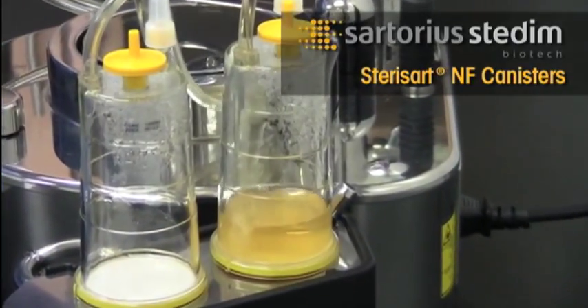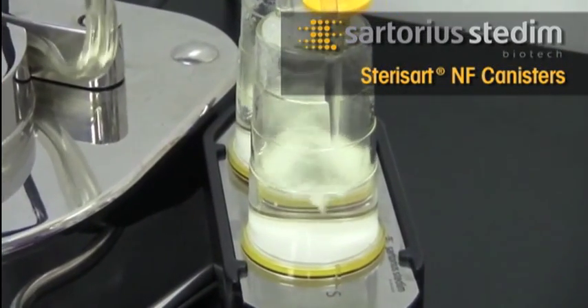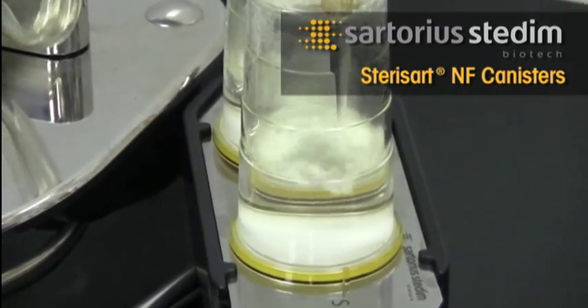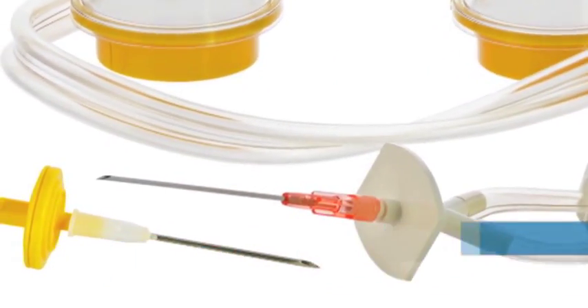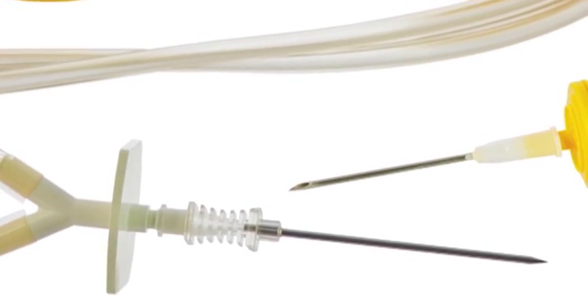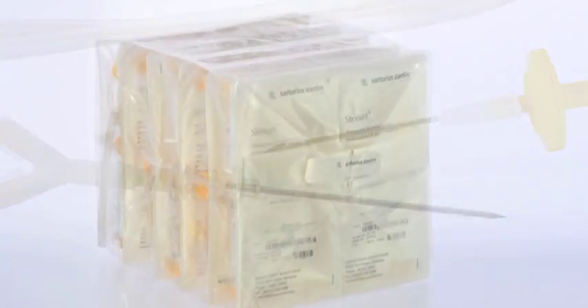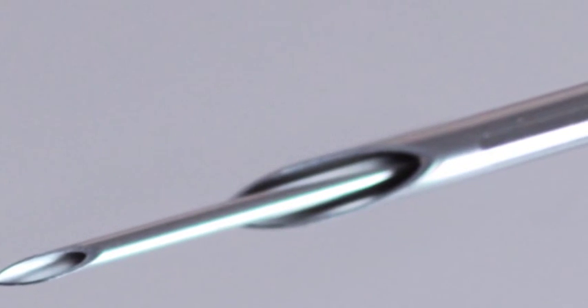The Sterisart NF canisters for sterility testing are disposable sample containers for use with the Sterisart Universal Pump. Sterisart NF canisters are available with a variety of needle styles, lure lock, and specialty connectors. They come double packed, are gamma irradiated, and feature stainless steel needles.